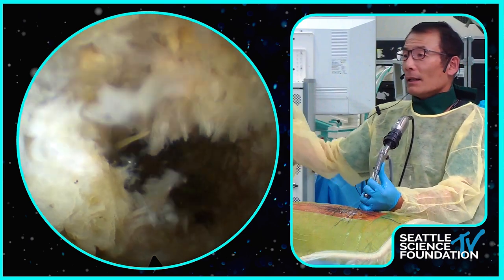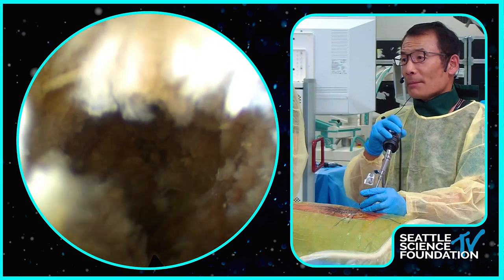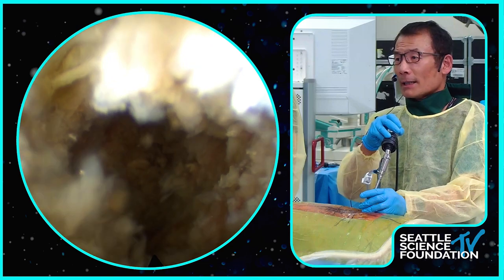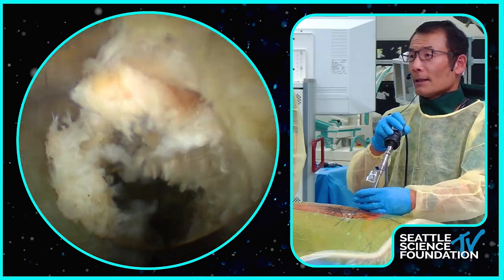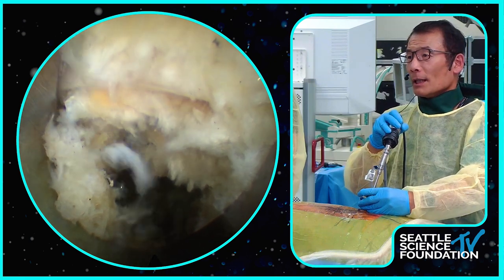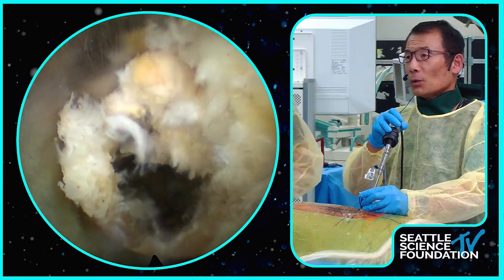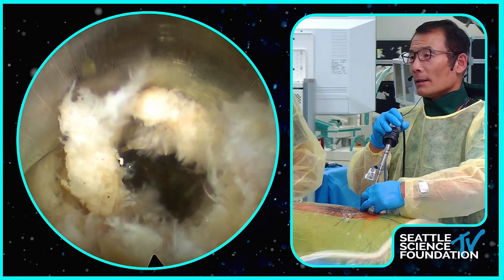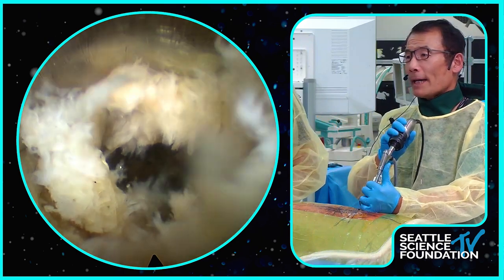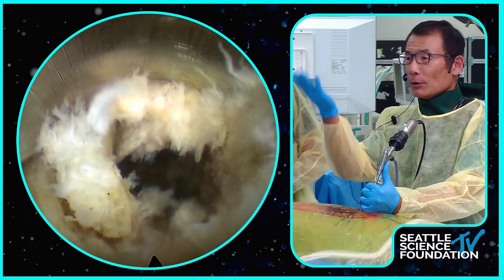If you look anterior into the disk space, I already did some of the discectomy work, and you can work all the way anteriorly to see the ALL and do your ALL release. So at this point, I'm ready to place the cage. To place the cage, I usually turn the endoscope, because for that amount of time, it's okay to retract where you're putting the trial and the cage in.